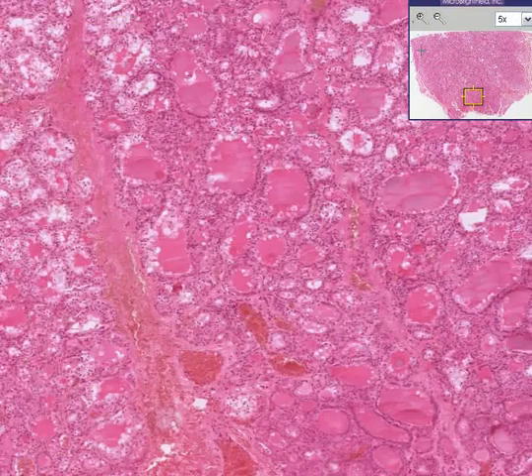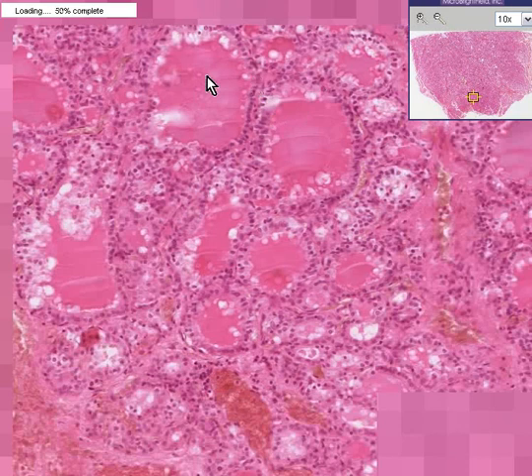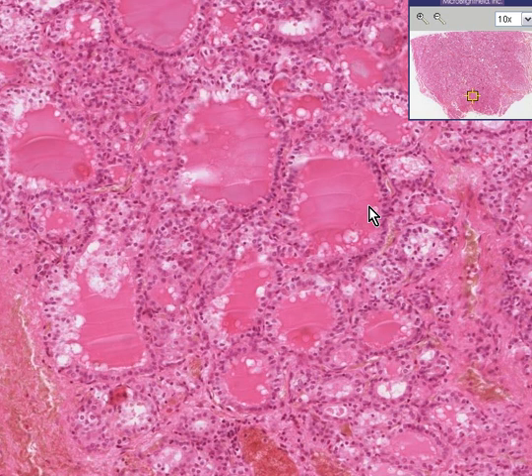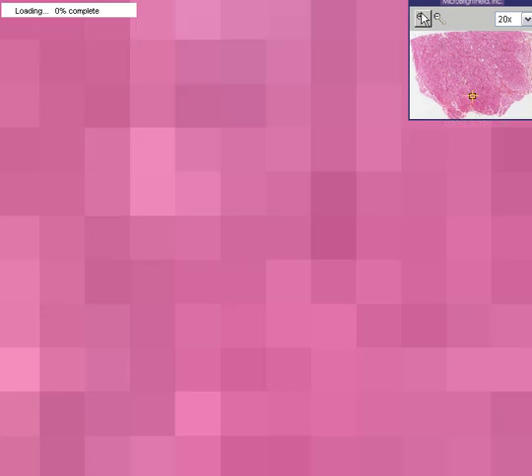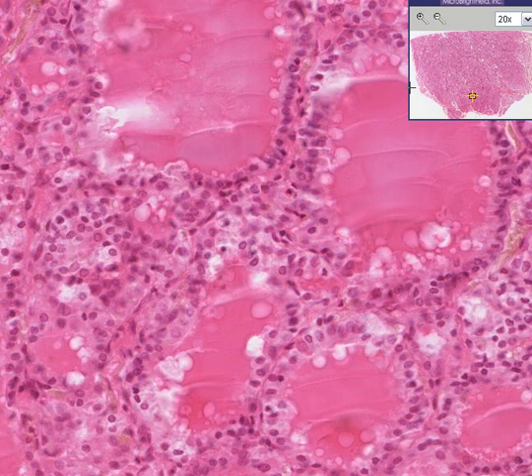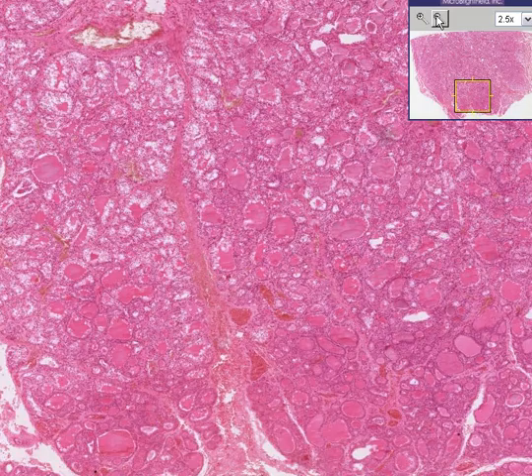Here are some follicles that are more normal in size, but notice they show scalloping here too. That's one of the most classical signs of hyperthyroidism. And of course, even though this gland is very active and there are a lot of cells, it is by no means malignant. It is very rare for thyroids which are hyperactive to have malignancy in them.